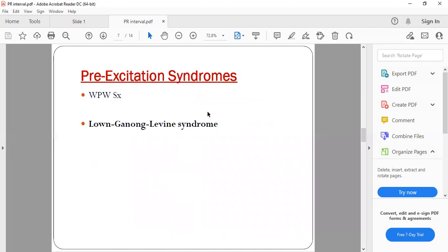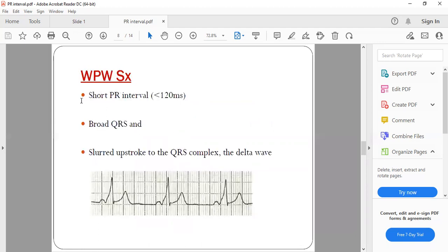There are two types of pre-excitation syndrome: WPW, that is Wolff-Parkinson-White syndrome, and Lown-Ganong-Levine syndrome. WPW syndrome is a pre-excitation syndrome with an accessory pathway and a short PR interval. You can see here the PR interval is around two and a half small squares — less than three small squares, that is less than 120 milliseconds. Other features of WPW syndrome include a broad QRS complex and a slurred upstroke characteristically called the delta wave.